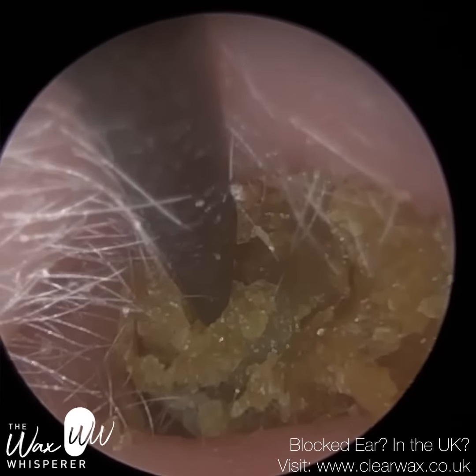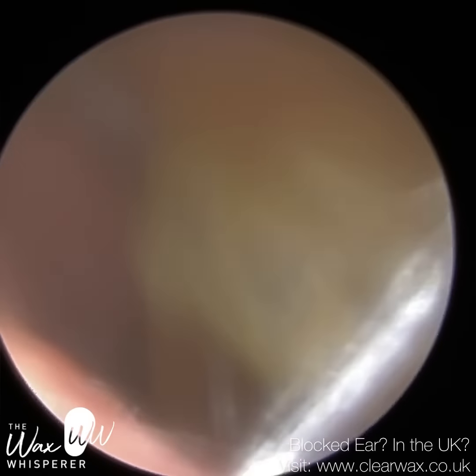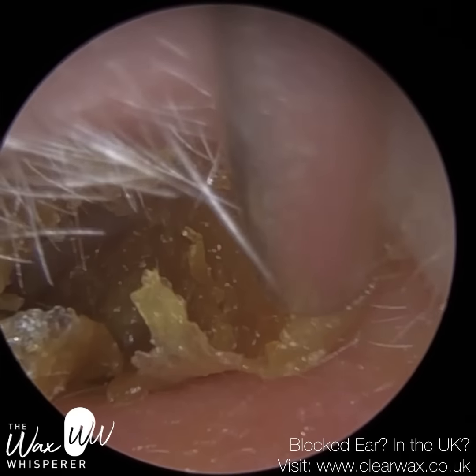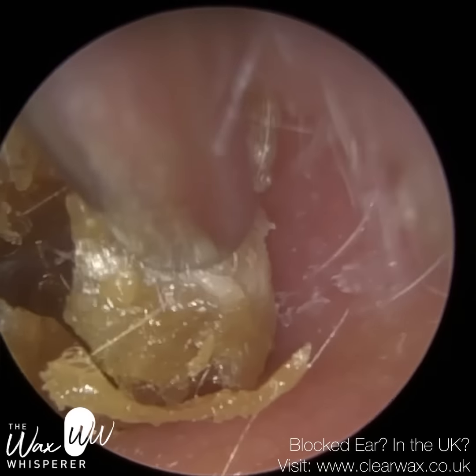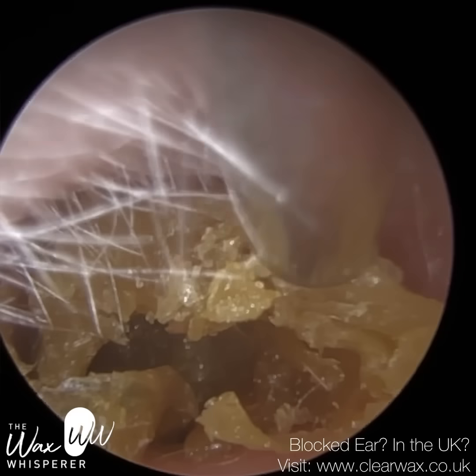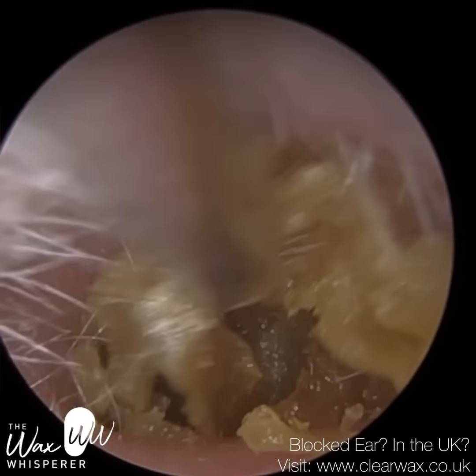In most of our ears, all this dead skin full of keratin, as it dies and sheds, should naturally migrate out of the ear like a conveyor belt. But in this patient, it's failed to fully migrate and it's formed into a plug. The outermost layer of this keratin is still slightly adhered to the canal wall. You may be able to see the whitish appearance on the peripheral side of this keratin. You can see I'm just separating that, so slightly adhered.